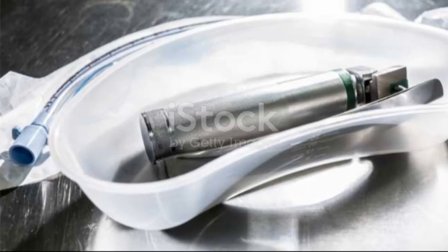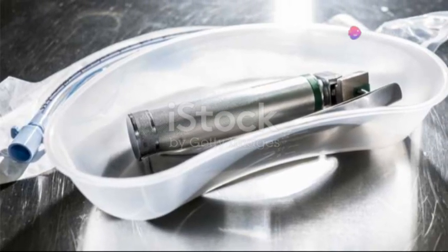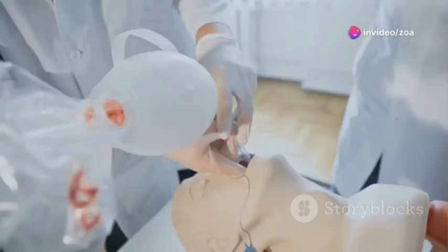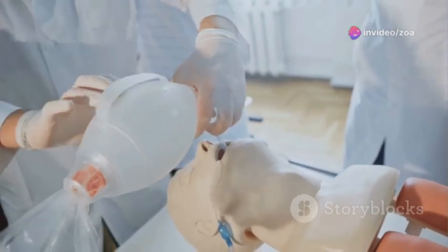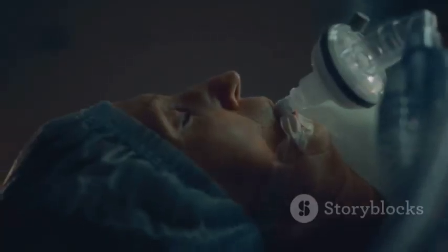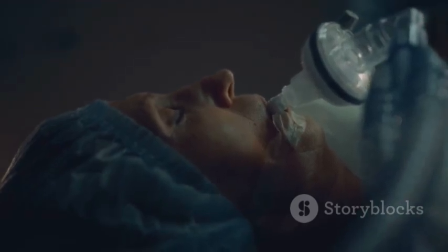Once the tube is in place, confirm placement by auscultating for bilateral breath sounds and observing for chest rise and fall. Secure the tube in place using a commercial endotracheal tube holder. Connect the tube to an oxygen source and confirm proper placement with capnography.